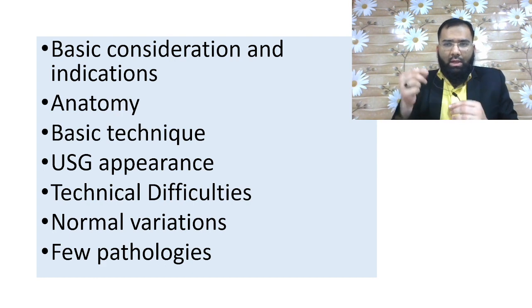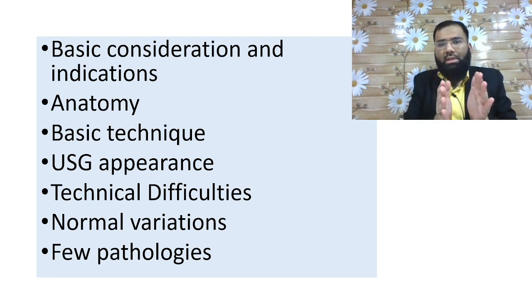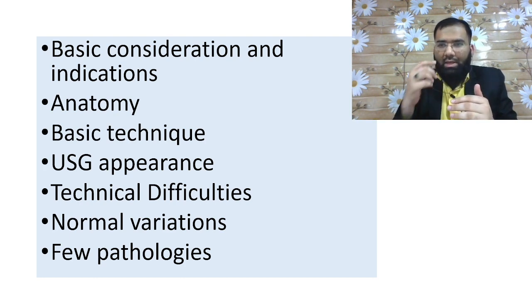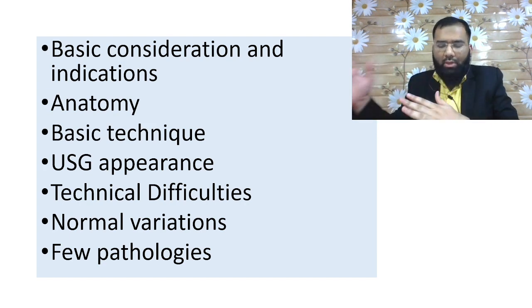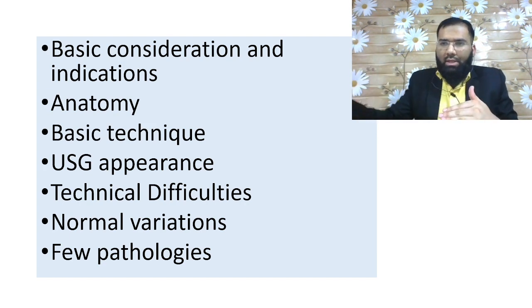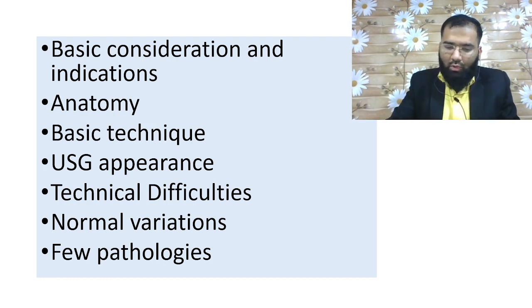See, this lecture is not for pathologies. This lecture is meant to discuss the kidney, the normal appearance of kidney, and we will be discussing few normal variants, and I'll touch upon pathologies, and subsequently in other lectures we'll also touch upon each pathology in details. So let us move ahead.